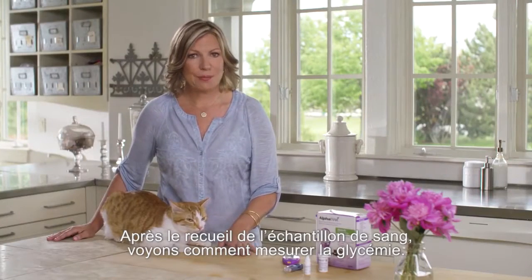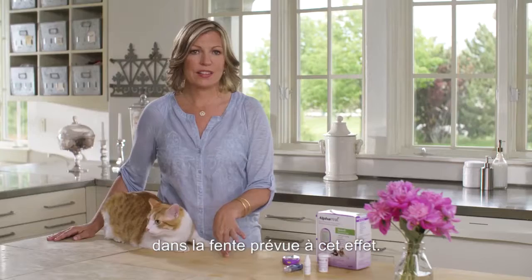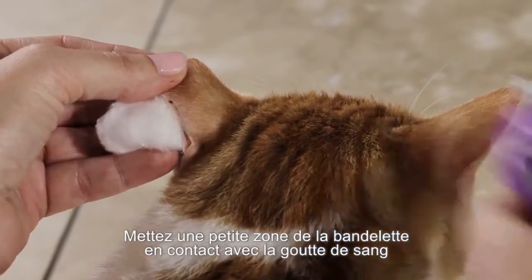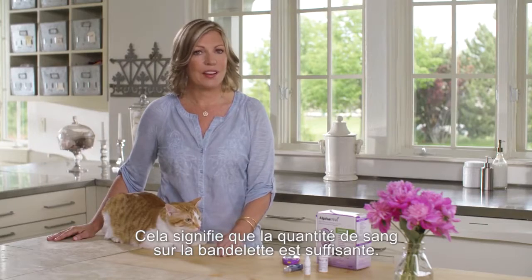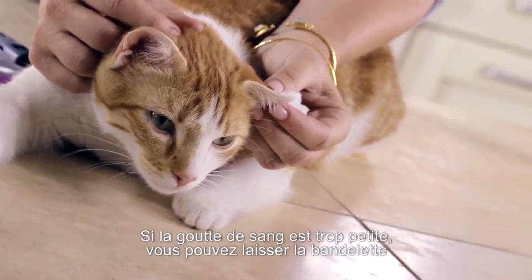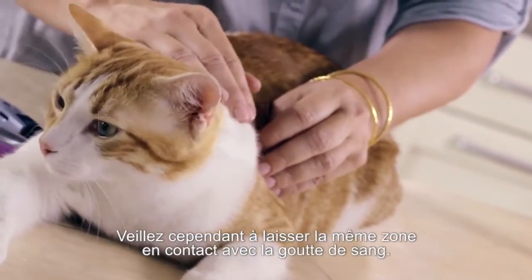Now that we know how to get a sample, let's see how to do a test. It's quick and easy. Once you've got a sample, turn the meter on by inserting the strip into the meter port. Quickly confirm that the code on the meter matches the code on the test strip vial. Touch one test strip sample area to the blood drop until you see the short lines moving clockwise on the meter display or you hear a beep. This means the test strip has enough blood and you will see results within seconds. If your blood drop was too small, you may add more blood to the same test strip sample area for up to 60 seconds. Make sure you add blood to the same side of the test strip though.